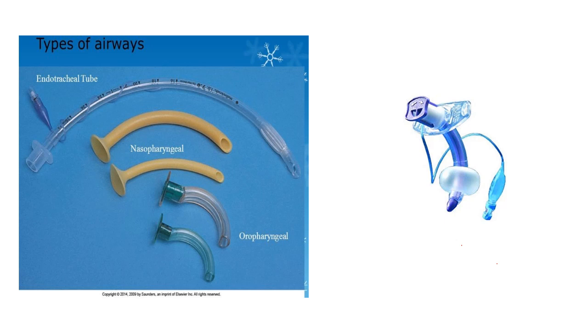And this is the endotracheal tube, which is made up of PVC, that is polyvinyl chloride. And here we have a balloon through which we inflate this cuff, right? And here we have a valve. We put this air syringe full with air and we inflate the balloon, and we inflate the cuff here. This is called the cuff.